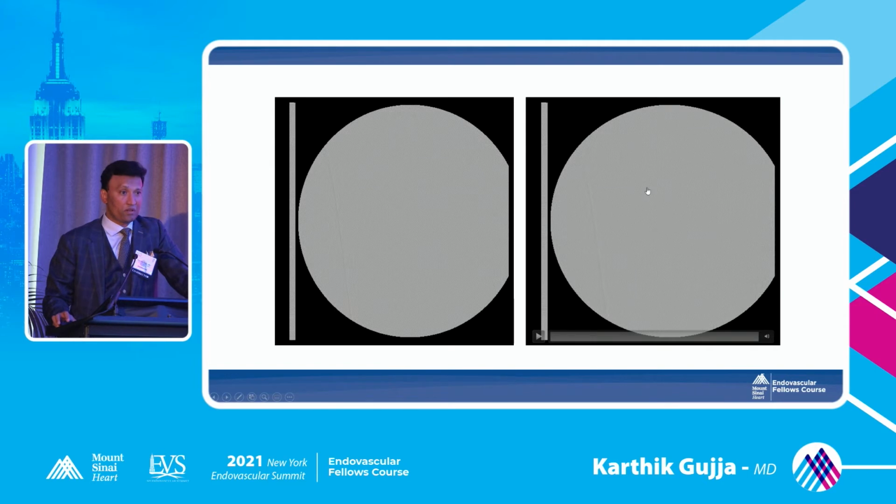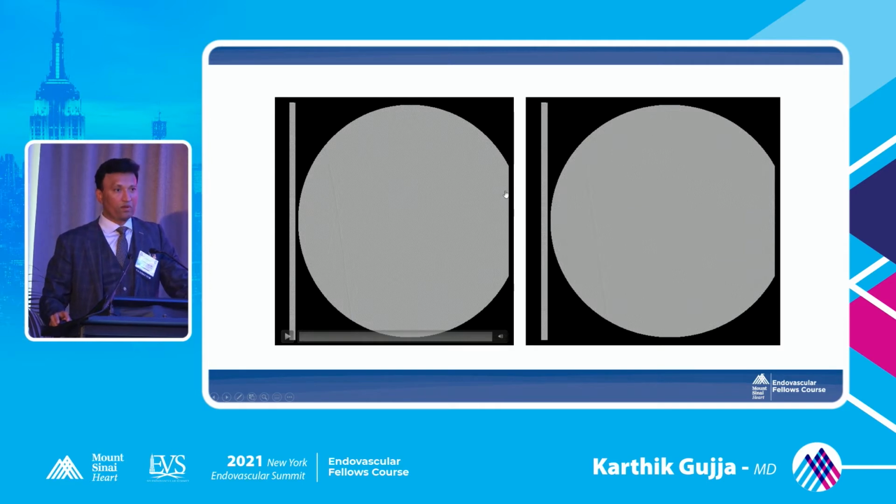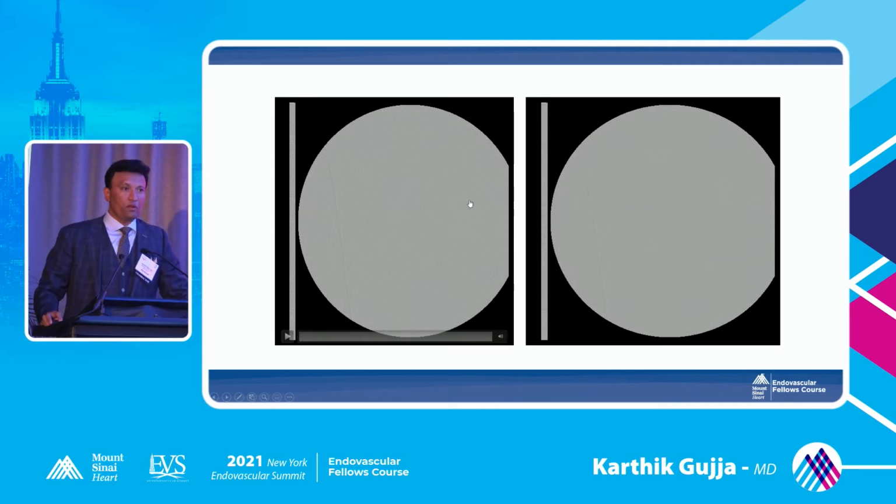I think Dr. Krishnan. So Dr. Gujja, you said atherectomy, balloon, stent, filter. So how do you justify the cost if you're going to use that in all CTOs? Is that an algorithm you follow for every single CTO? Are there markers of when you use a filter, when you don't, and how do you decide on what device to use based on what?